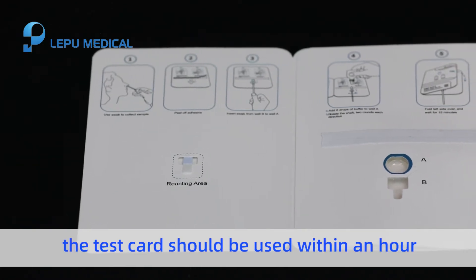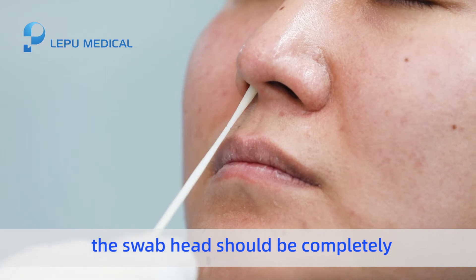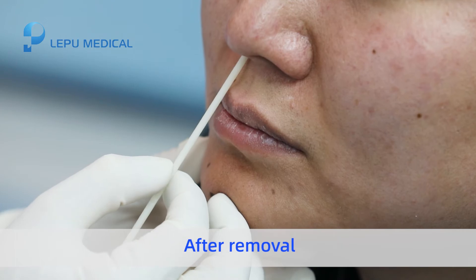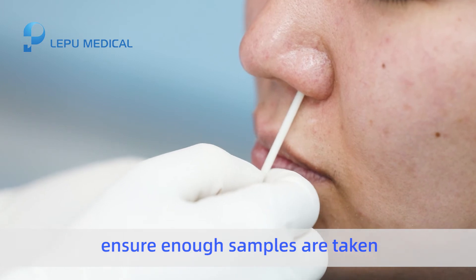Once opened, the test card should be used within an hour. Use a nasal swab to collect samples. During sampling, the swab head should be completely inserted into the nasal cavity and gently rotated five times. After removal, sample the other nasal cavity the same way to ensure enough samples are taken.